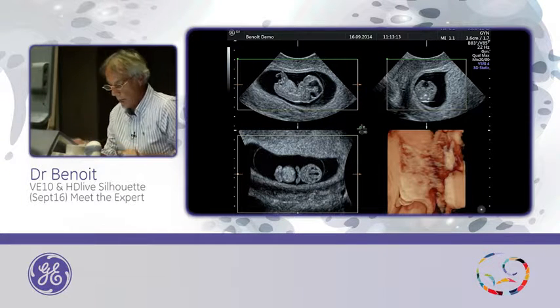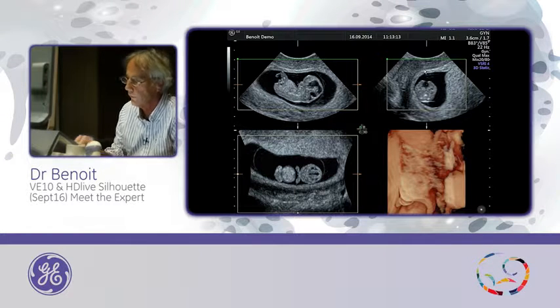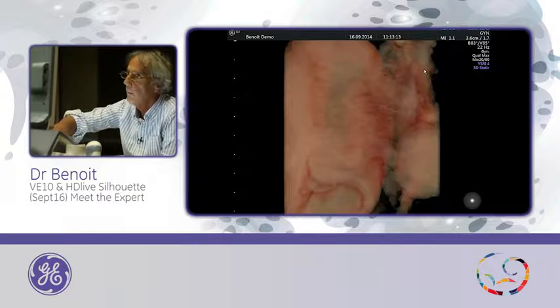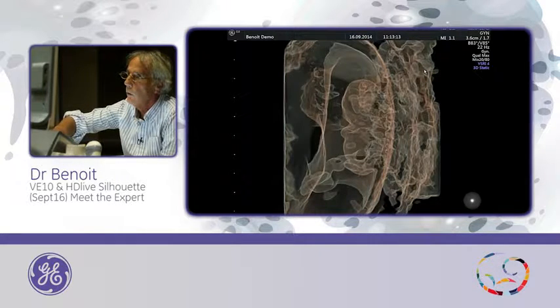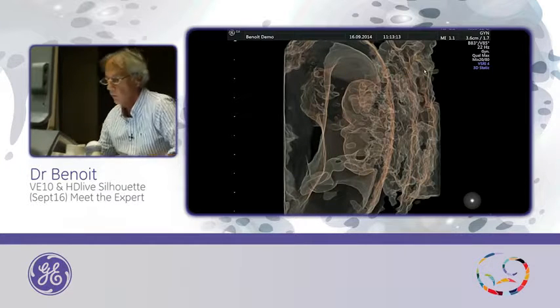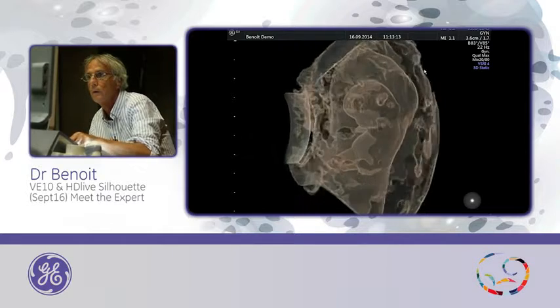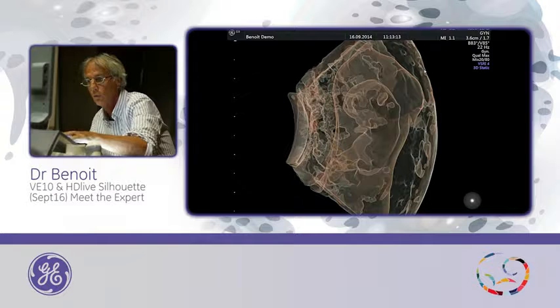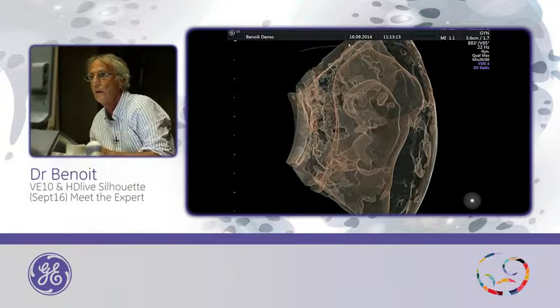This is a random mode with the HD Life, but what you can see here is only this green line, the surface. And when you increase the silhouette, you can see with transparency the embryo inside. And now we can turn around. And with this, it's really easier now to use a magic cut, because when you use a magic cut, you know exactly where you can cut.